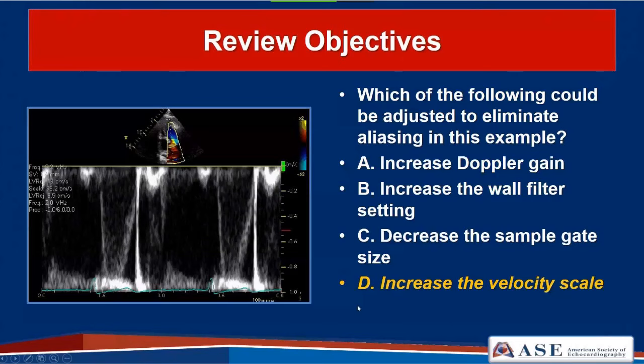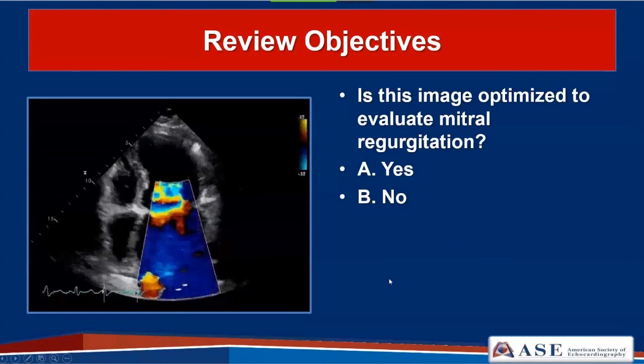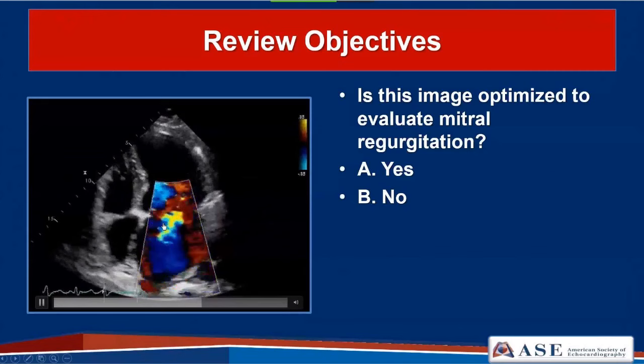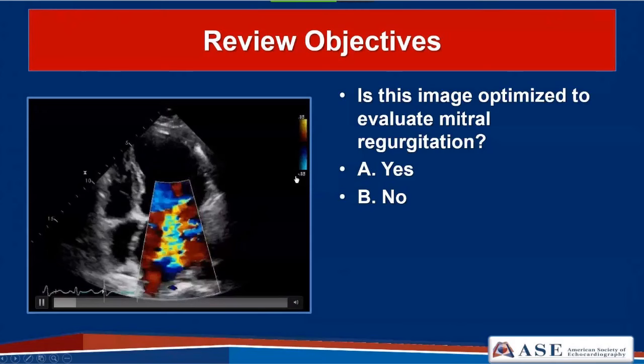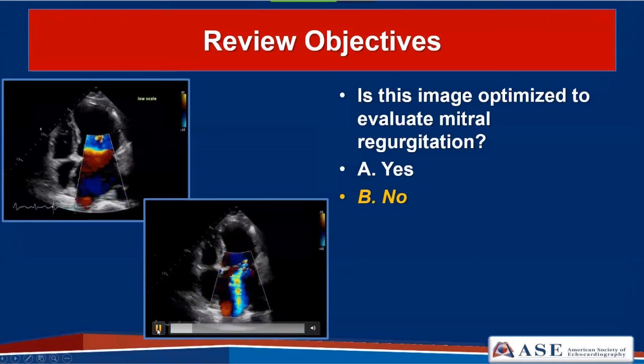Next review question: is this image optimized to evaluate mitral regurgitation? Looking at the large jet and the scale set at 0.35—that's too low—so this image is not optimized. When we adjust the scale to 0.62, we now have adequate depiction of the mitral regurgitation and have optimized our image.